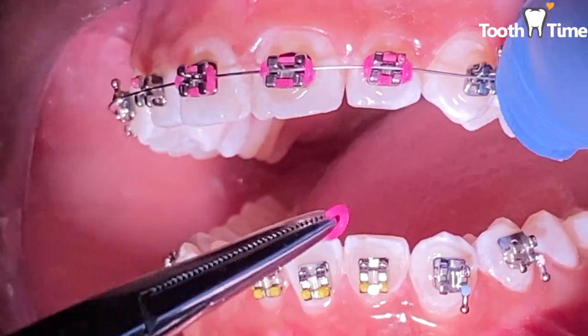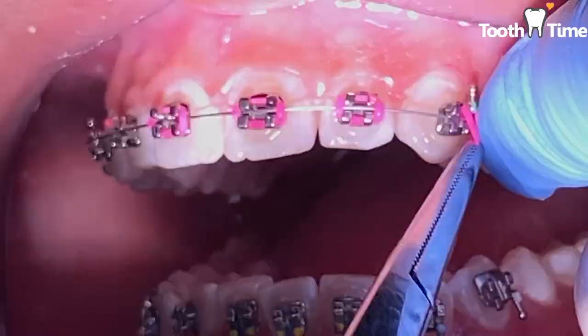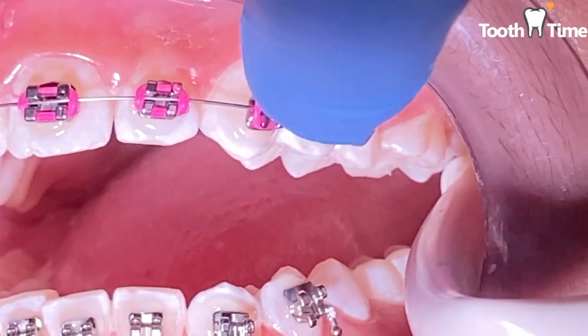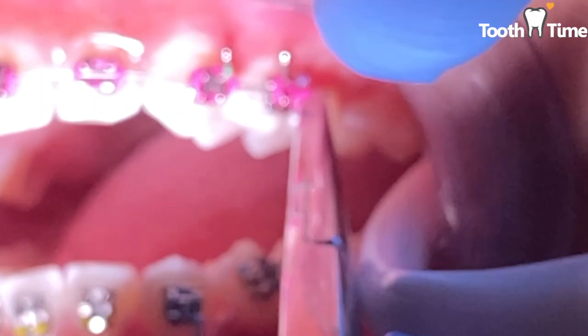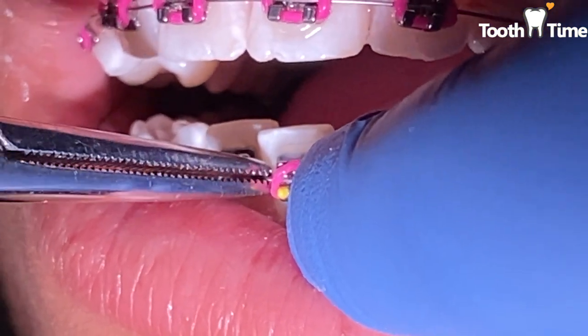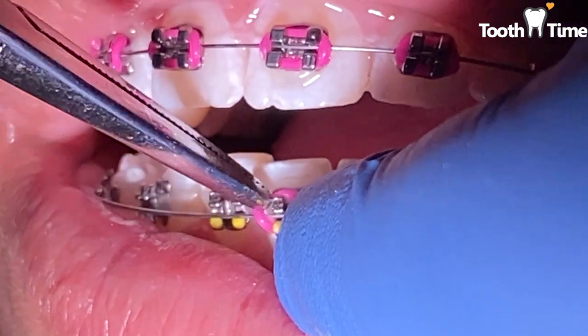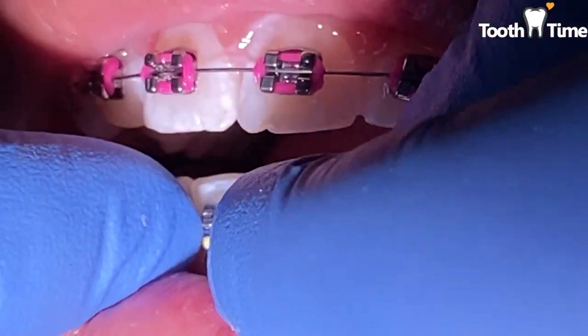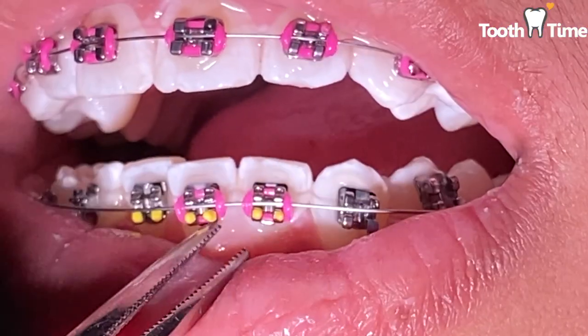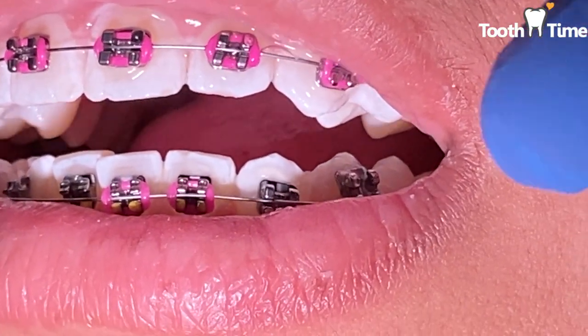Now we're going to place her wires and her color ties. Remember when you first start your ortho treatment there's a series of wires you have to go through. The very first wire she's getting is what we call an 012 NiTi wire — it's very thin and flexible, so she won't feel as much. As we transition to other wires she'll start to feel them get a little more aggressive, but by then most patients are already used to the adjustments and tightening.